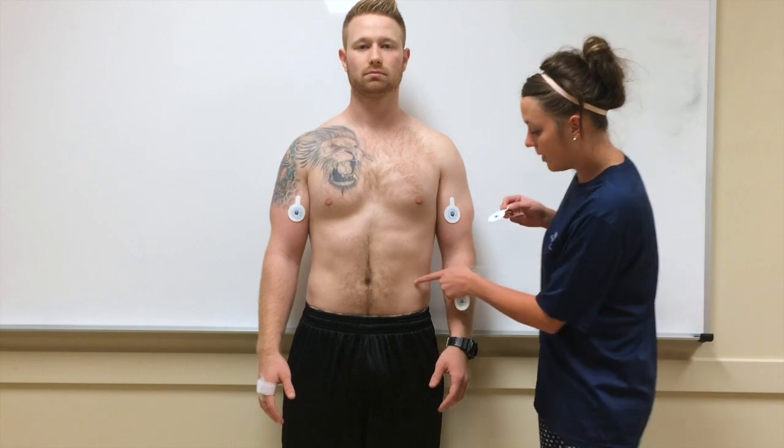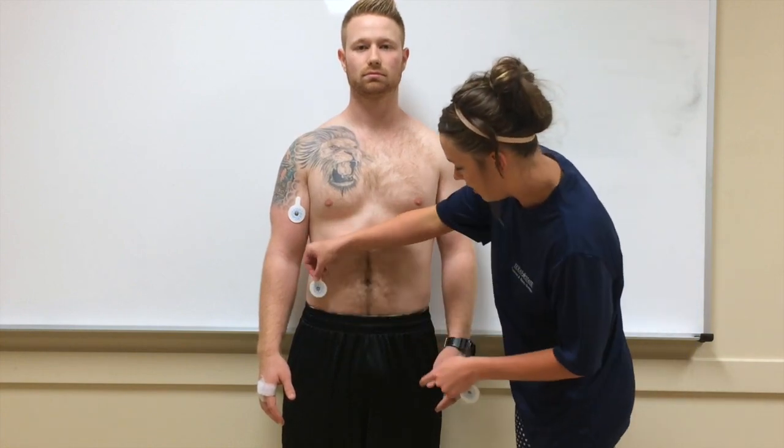Next, I will do the leg limbs. Also, if your client is in the same condition as before, you can place them right here on the hips.